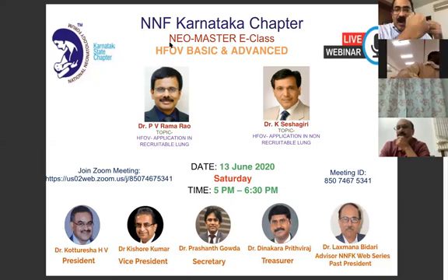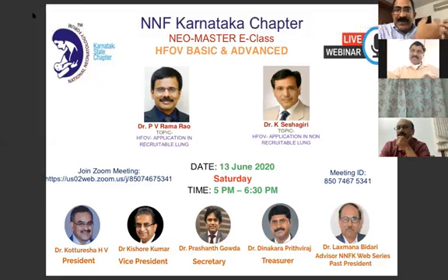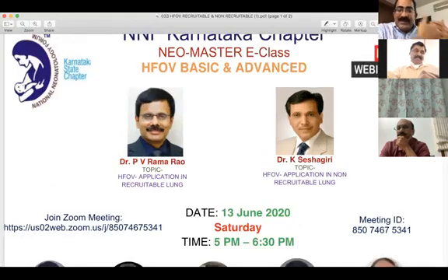As I said, there is no single number. There is no magic number. The magic number here is what it is that we need for this child. As we've said, let us say CO2 was only about 70 and we know it's a sick child. So let us say I have SensorMedics. I have my delta P around 60 and I've used a frequency of 8.